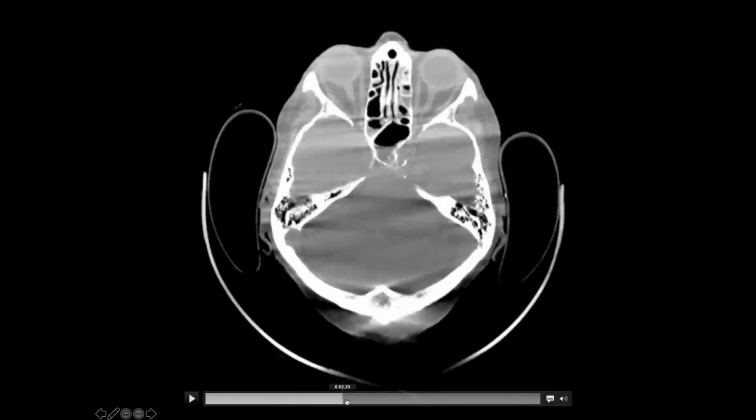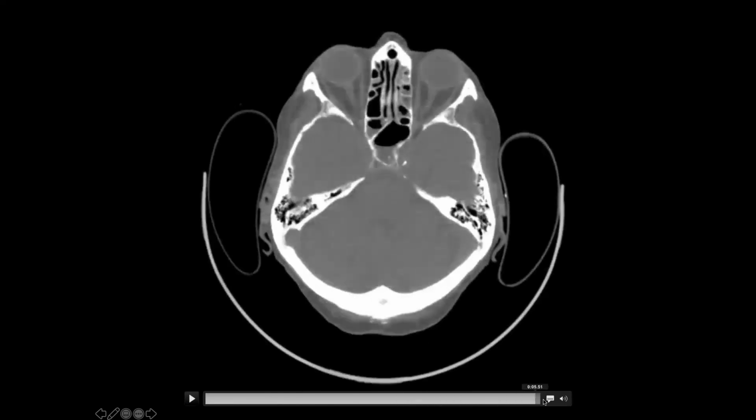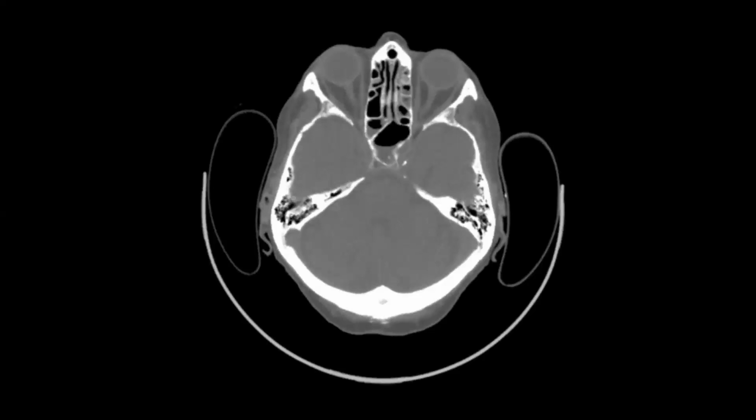So it comes around, we build those edges, we've gone through 180, and then we get right to the end, right? And then that's the object. After you have done approximately 400 projections or something and put it back together, you get this. Okay.